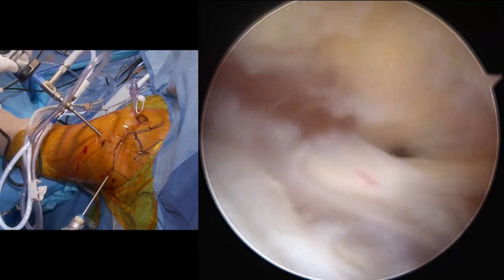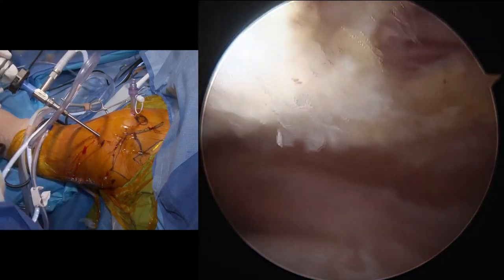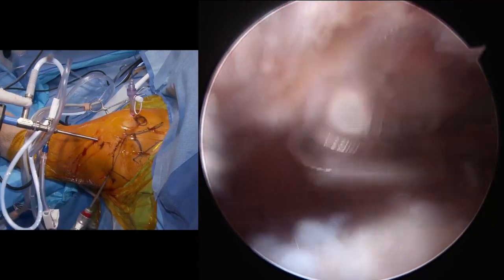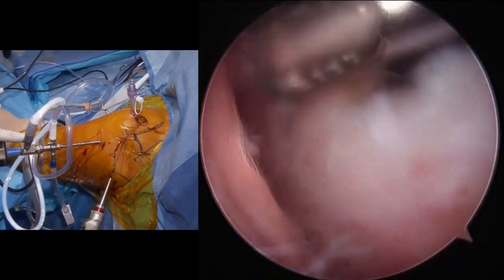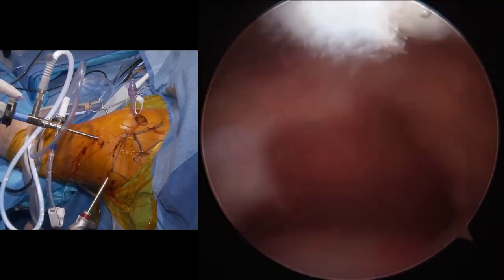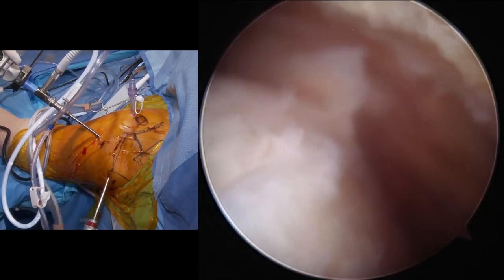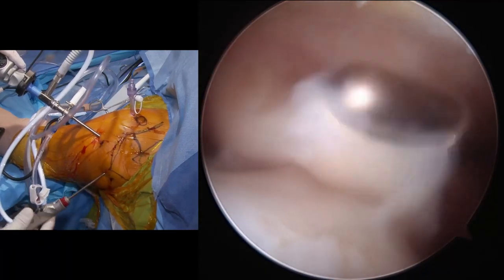Is this the aggressive shaver? No, that's the small. Yeah, let me have the more aggressive one, please. I'm just getting a lot of stuff in here, but. This went from a slam dunk, easy bursal-sided tear to one that's going to be tricky and may have a hard time getting it all the way back, interestingly.